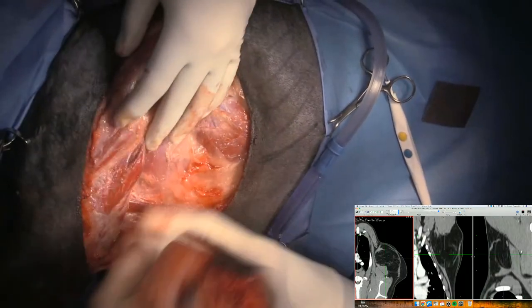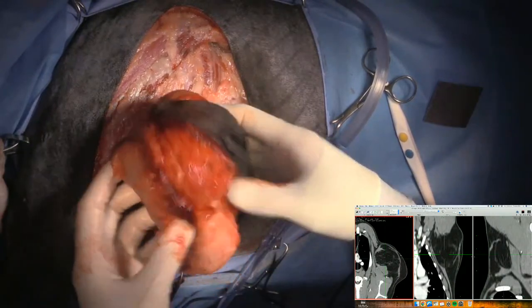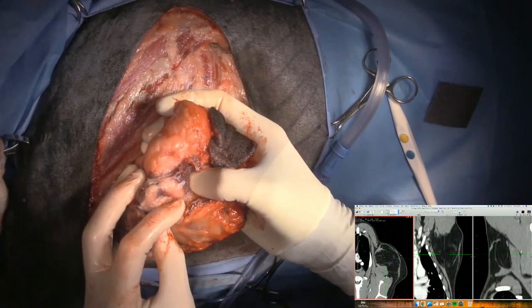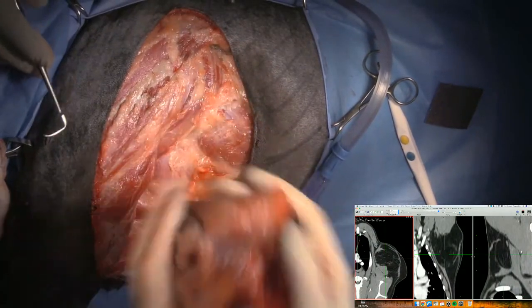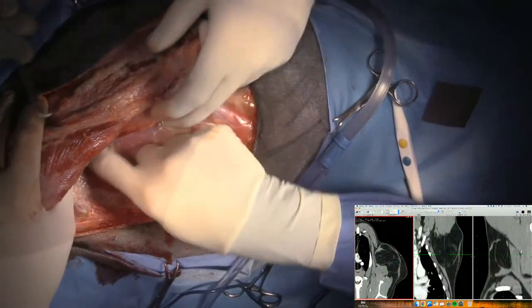So that's the tumor out, and we can see it's completely encapsulated, or the attachment is completely encapsulated within the latissimus dorsi muscle. And you can even see some of the fatty tumor infiltrating through the muscle fibers there. So that is very, very cool. All right, so let's have a look in here and make sure we're happy.